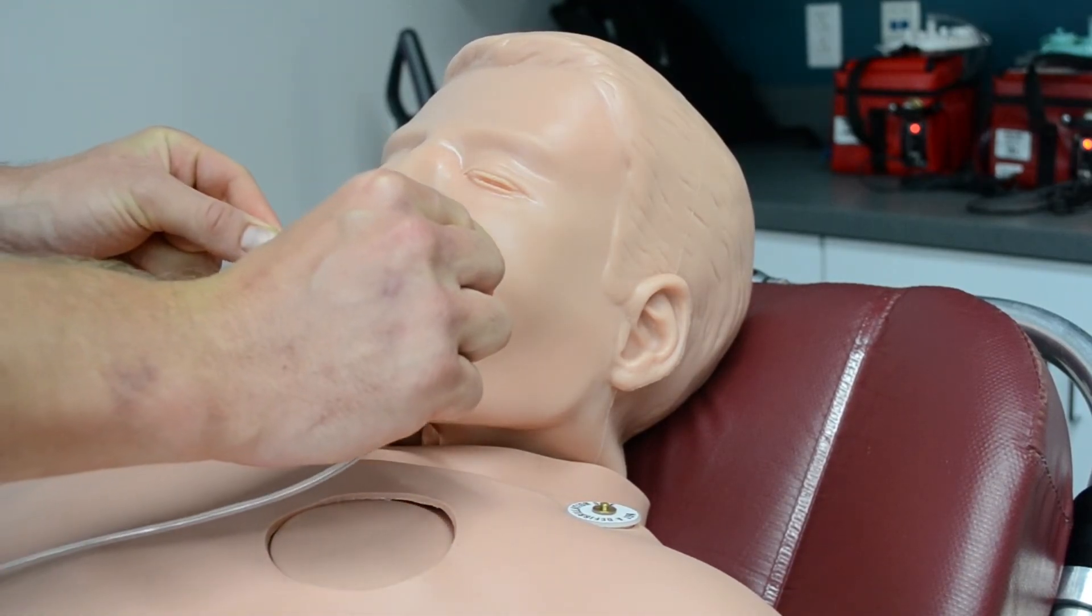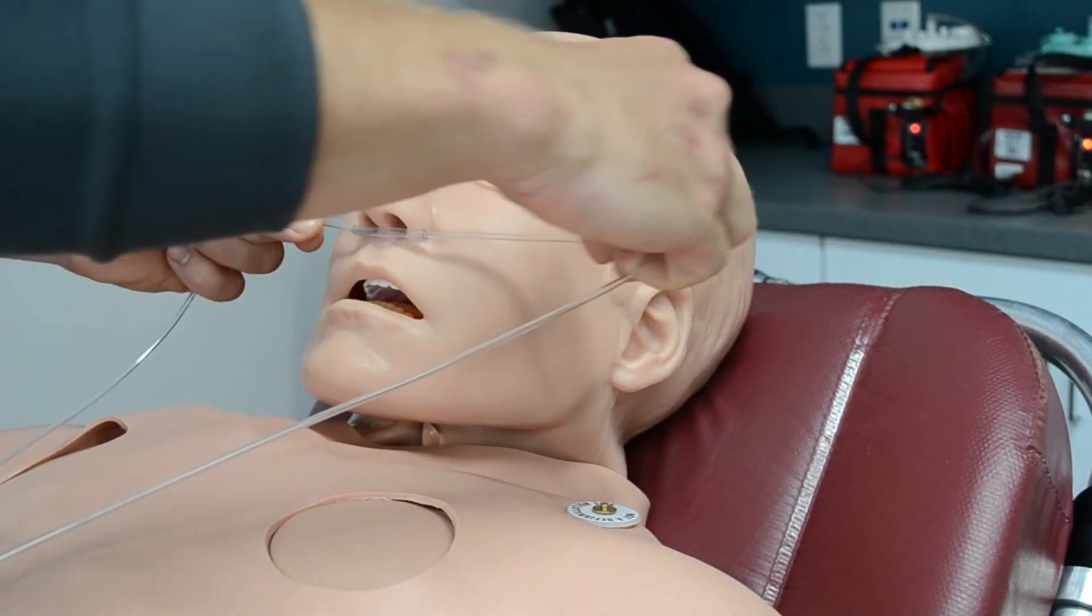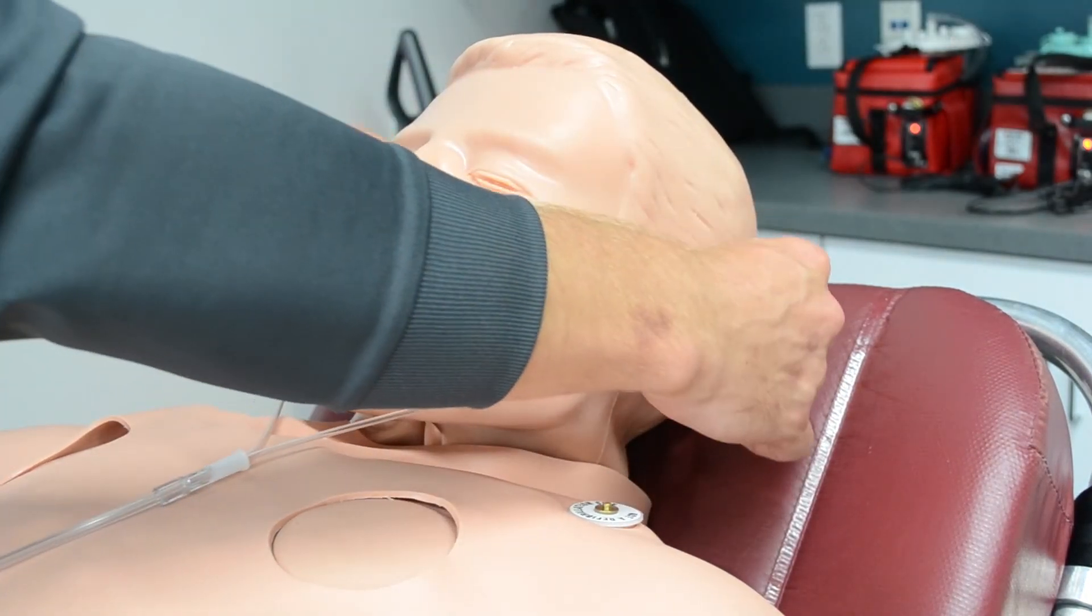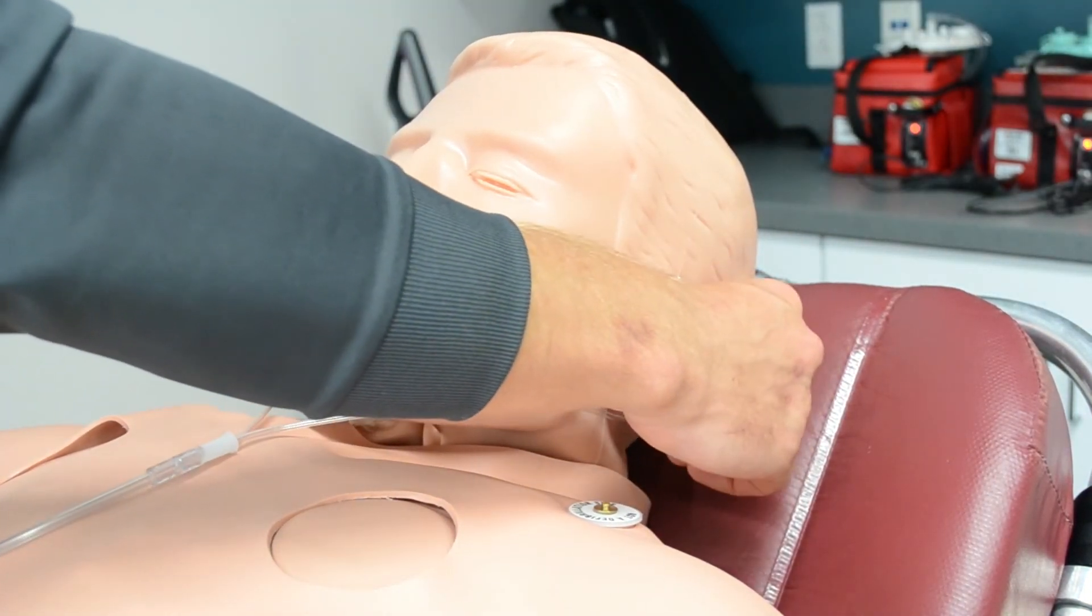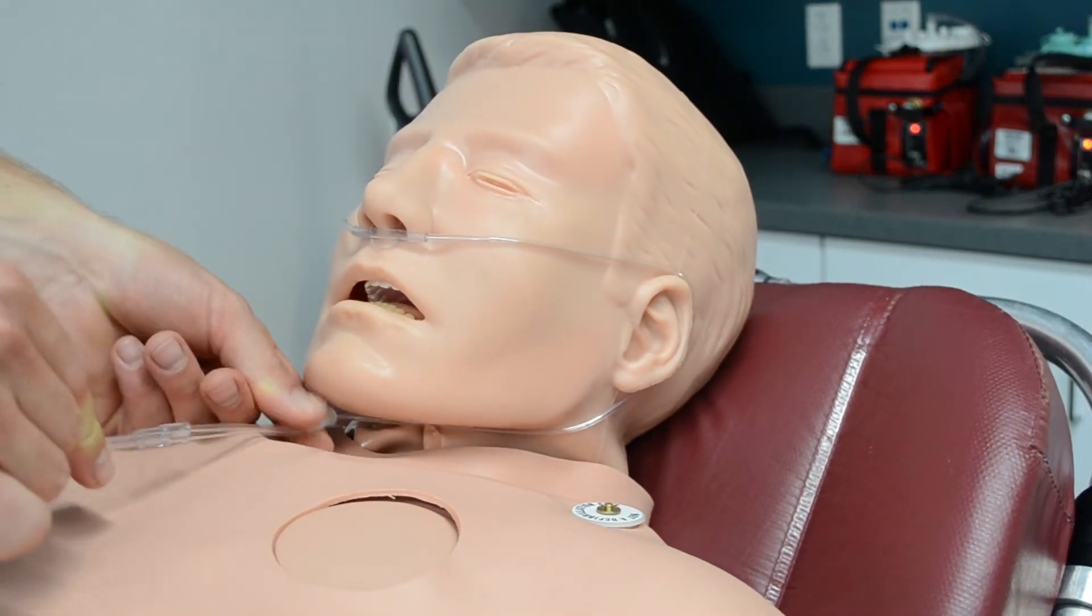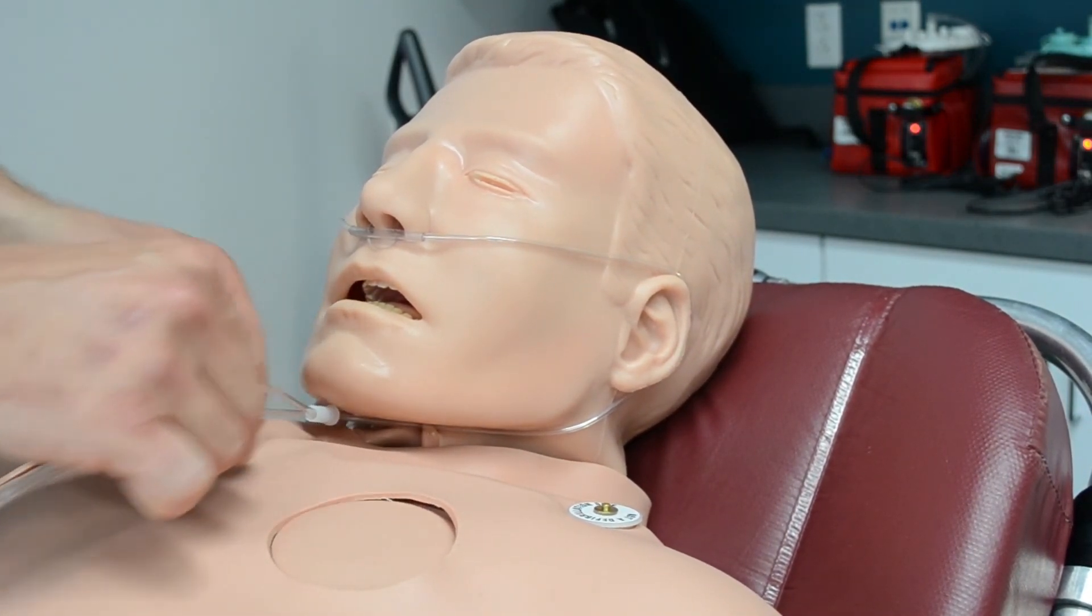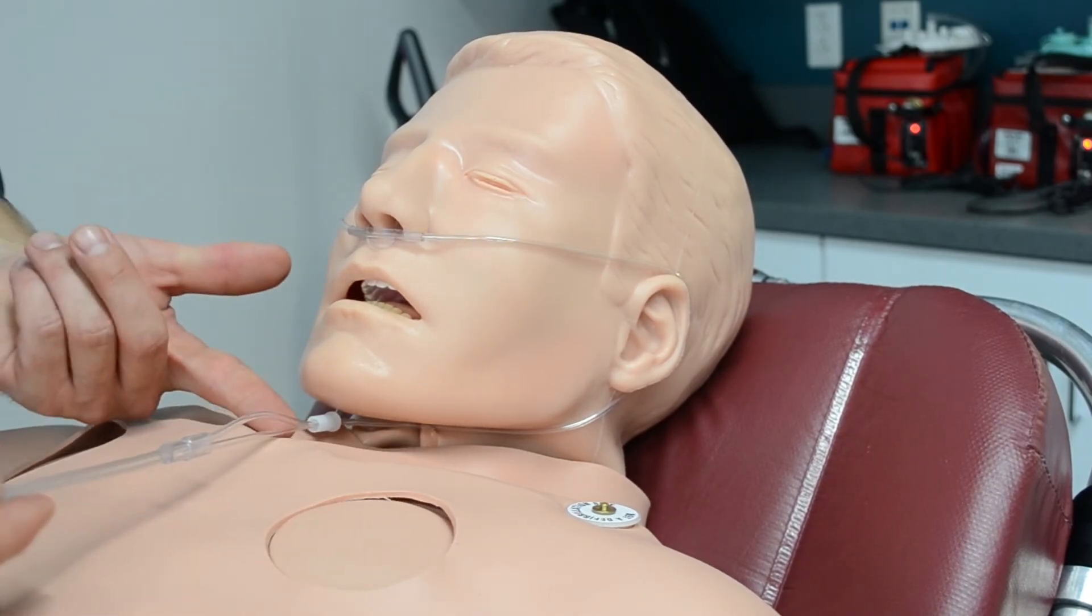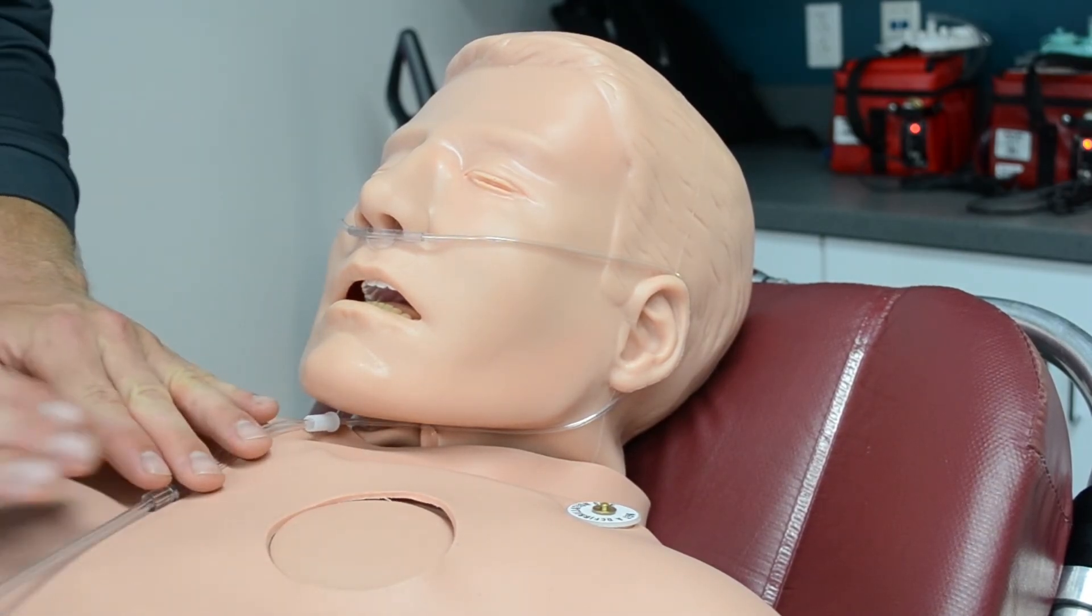Then loop around the ears and cinch down. The chin piece doesn't need to be too tight, just enough to keep it secure so that this O2 line is running down the anterior part of the patient.